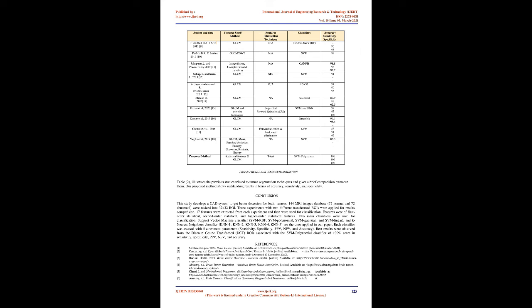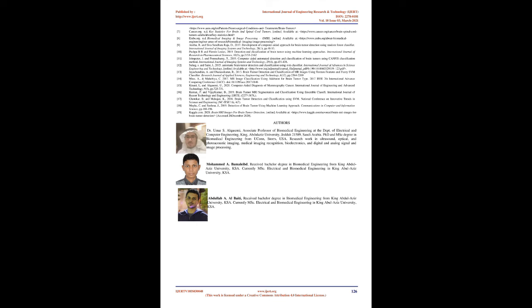Accuracy comparison of original ROI, radon, and discrete cosine transforms. Discrete cosine transform gives the best results for detecting brain tumor in 4 types of support vector machine classifier: SVM RBF, SVM polynomial, SVM Gaussian, and SVM linear, and 5 types of K nearest neighbors classifier: KNN1, KNN2, KNN3, KNN4, KNN5. Applying the t-test obtained 17 useful features, p-value 0.05, shown in figure 5.